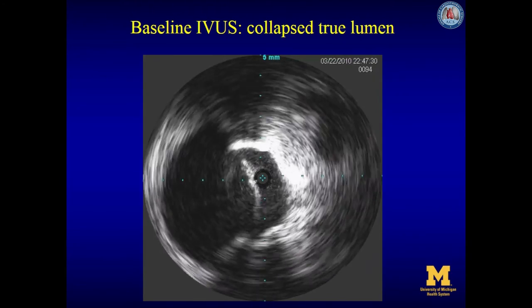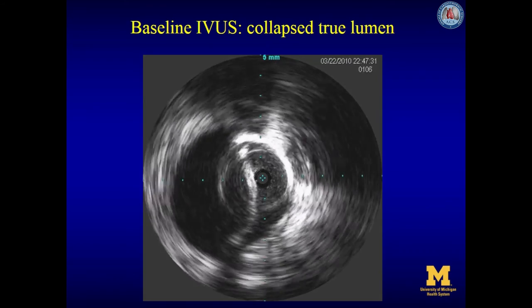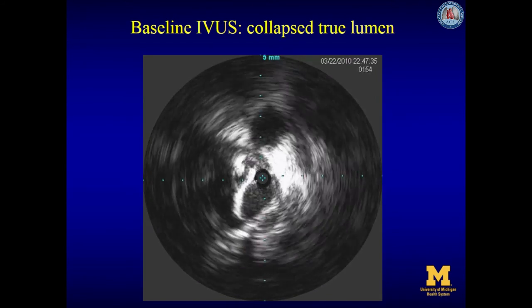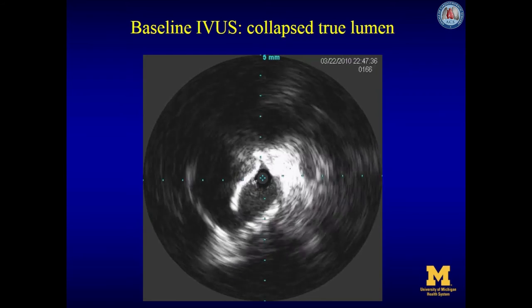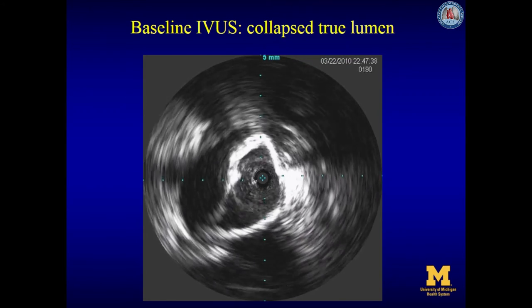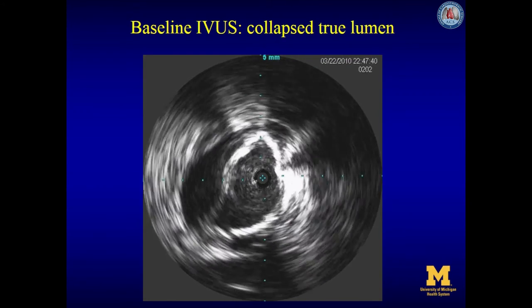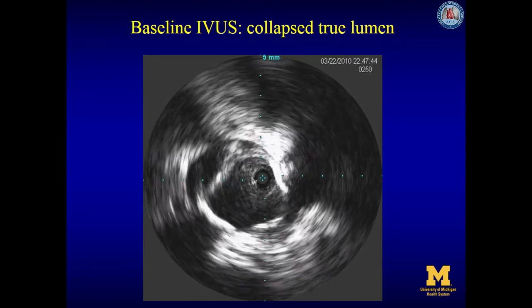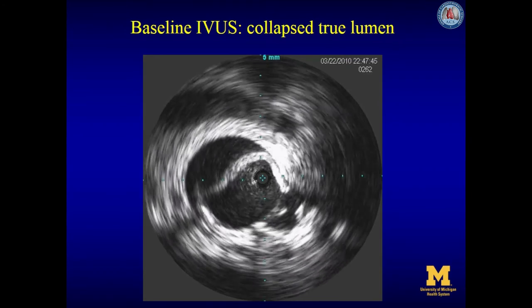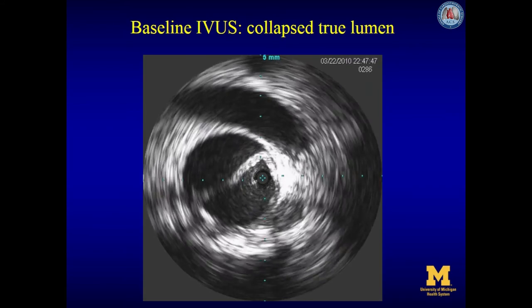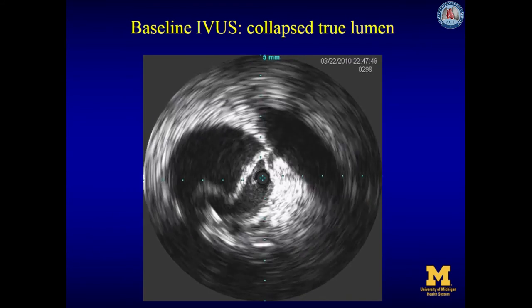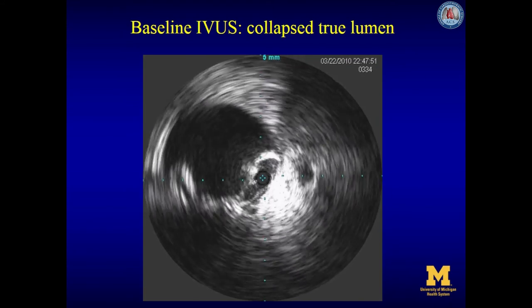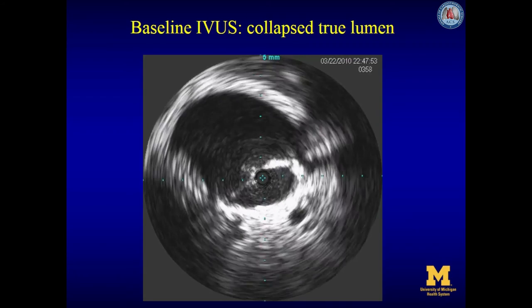The celiac artery is coming off at 12 o'clock with the collapsed true lumen. The superior mesenteric artery is coming off at 12 to 12:30 from the collapsed true lumen. The left renal artery is coming off at the right side of the screen, with the renal vein crossing the front of the area. Here we are in the infrarenal aorta with collapsed true lumen.